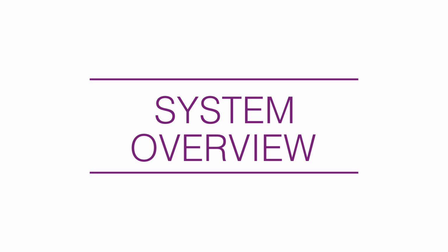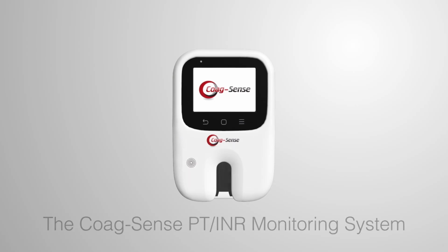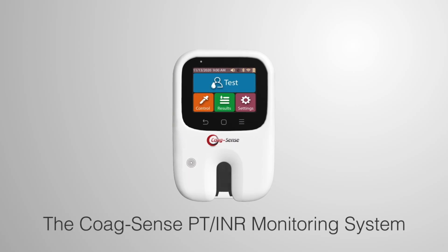Introduction and System Overview. Thank you for choosing the Coag-Sense PT INR Monitoring System.